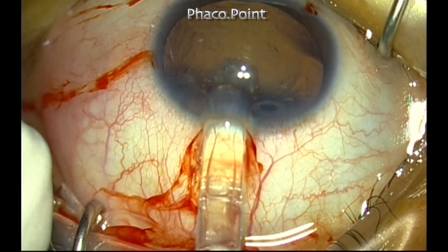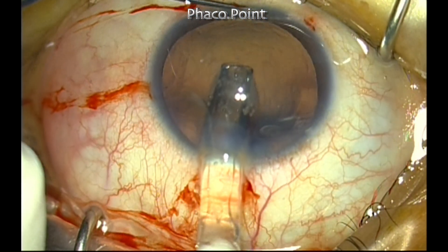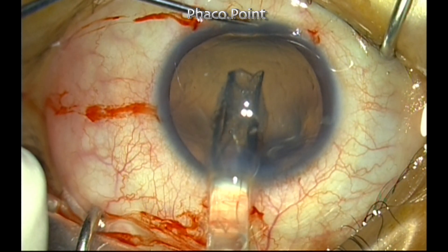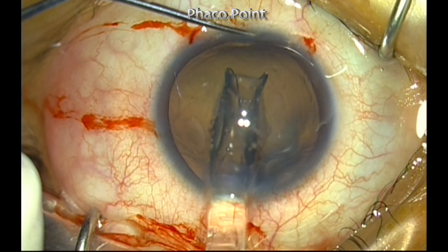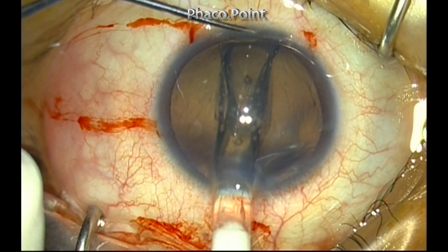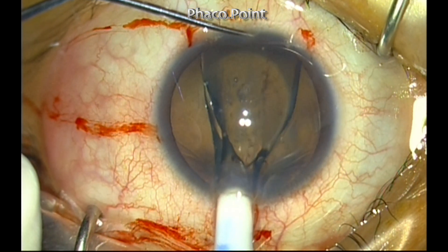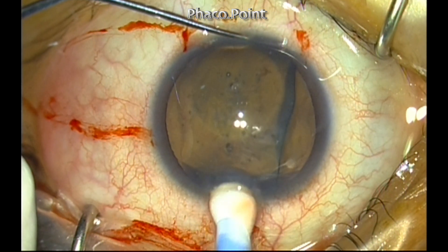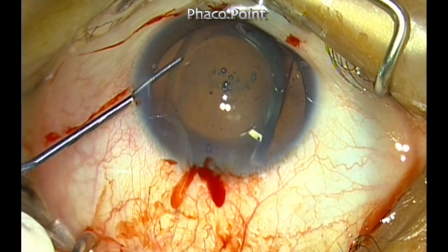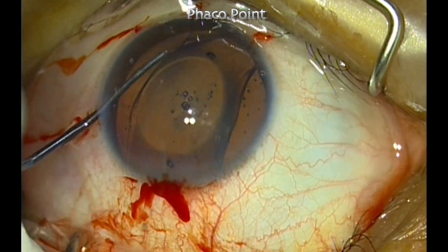For the second eye surgery, I am implanting the ICL in a vertical direction, as you can see. I make sure the ICL unfurls extremely slowly and the perforated portion of the haptic lies to the right. Each portion of the haptic is then tucked behind the iris into the ciliary sulcus region.